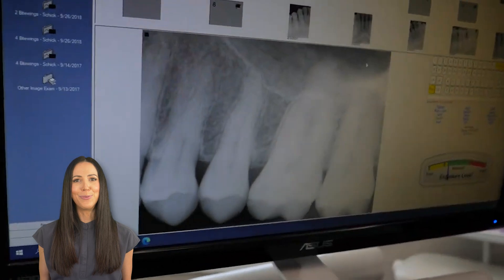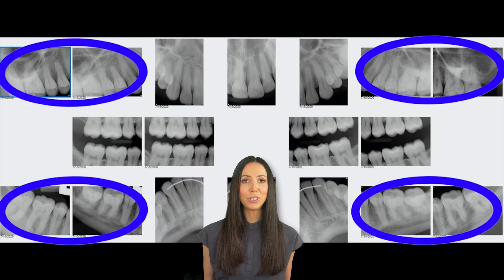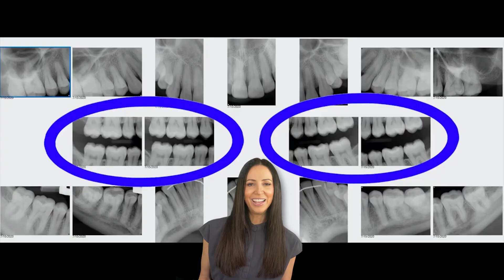After we finish the PAs, we'll move on to the bite-wings, which you will see at the end. Most FMX full mouth x-rays are about 18 images in total — six anteriors and eight posteriors — and then we'll finish up this last x-ray and set up for the bite-wing x-rays.